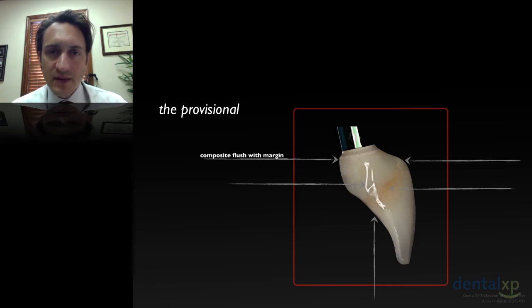From a surgical perspective, plastic abutments have a lot of advantages. I have used titanium in the past. I find them to be very unforgiving, and it makes it very easy for me to provide a provisional solution on a plastic abutment. It gives me a latitude that I find I don't have with titanium. That's my personal preference.